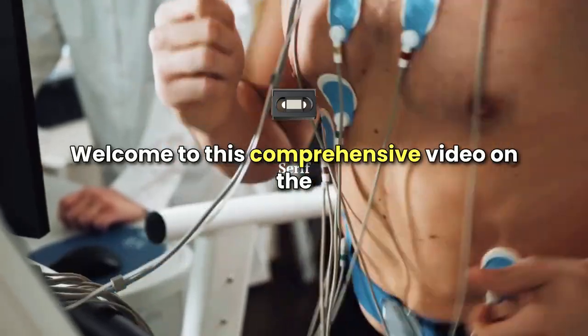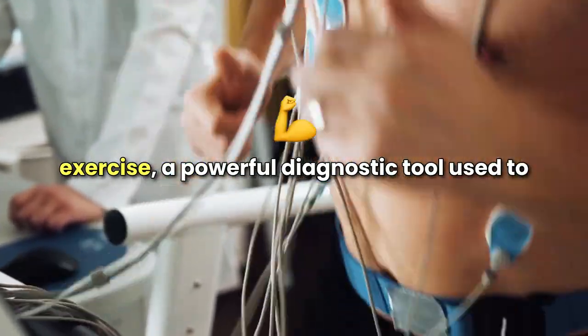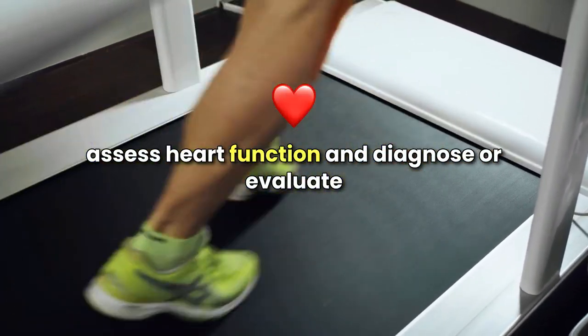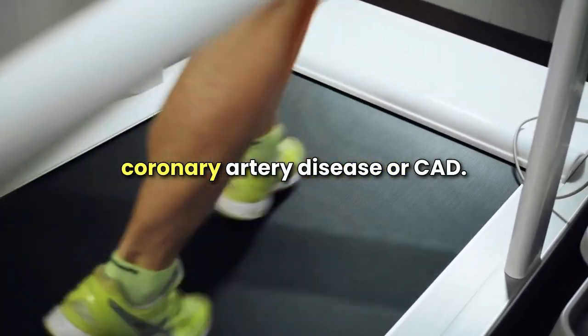Welcome to this comprehensive video on the clinical indications for stress echocardiography by physical exercise, a powerful diagnostic tool used to assess heart function and diagnose or evaluate various cardiac conditions. Let's start with the evaluation of coronary artery disease, or CAD.